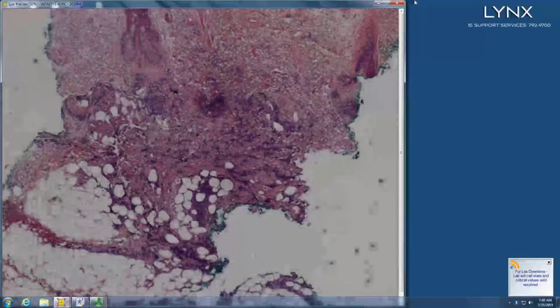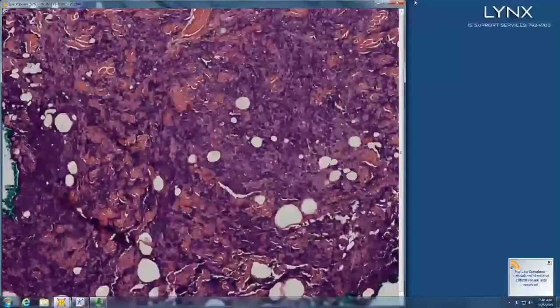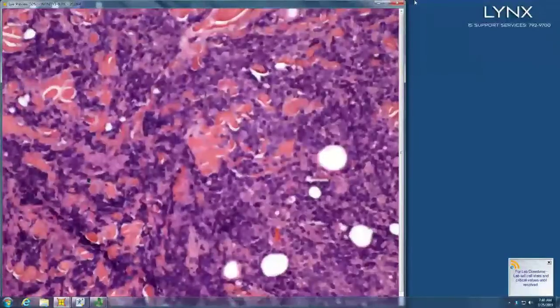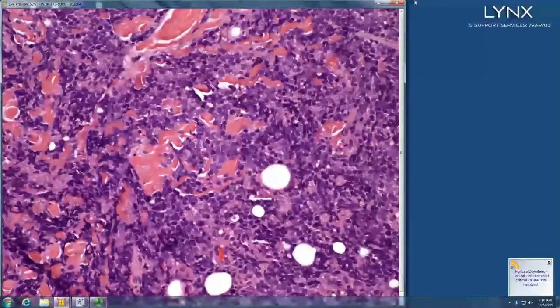So we've got a lot of lymphoid cells deep around the deep dermis and fat. Some said histiocytes, you said lymphoid cells. Yes, just very lymphoid, very blue cells. So give me a blue cell differential.